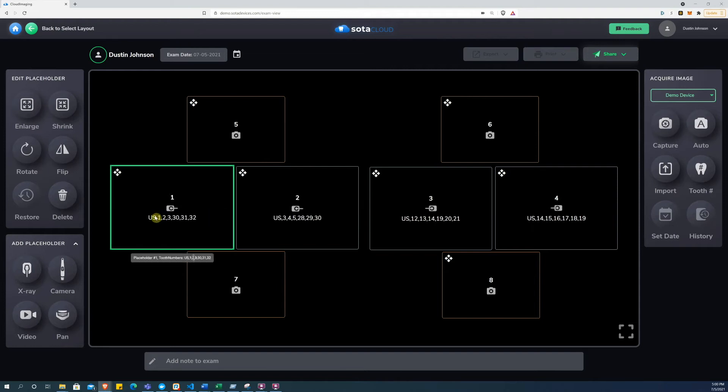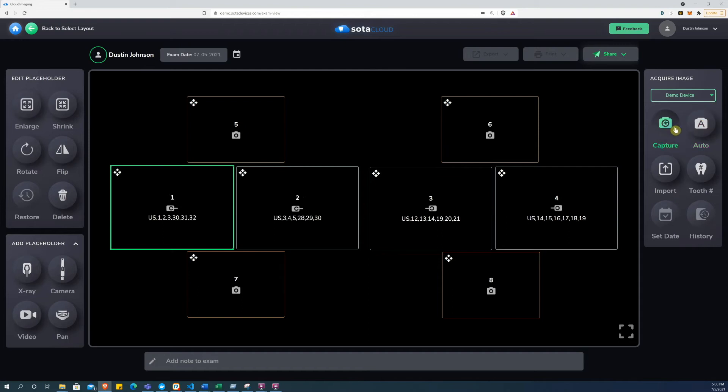Finally, I will hit the Auto button to start the exam, or the Capture button to take just one image. In this case, I will click Auto to take a full exam.